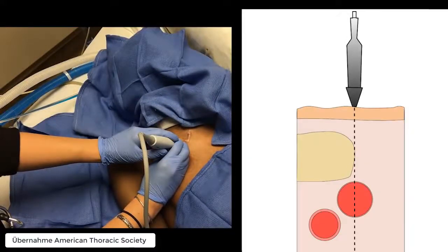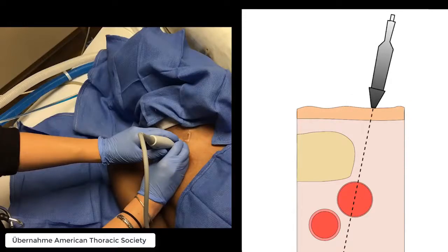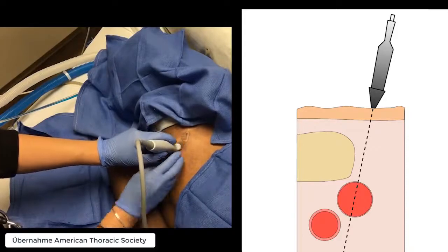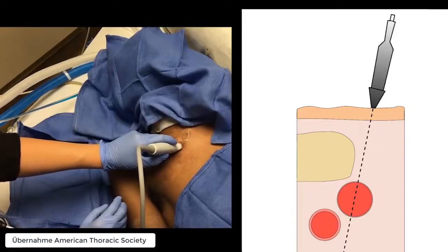Oftentimes in longitudinal view, the subclavian vein is partially obscured on ultrasound by the more superficial clavicle. Adding a slight tilt with the ultrasound probe tip pointed more towards the patient's head can overcome this to give a clearer view and route for needle access.